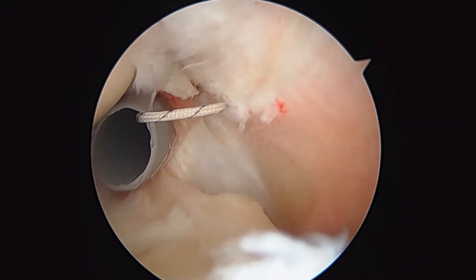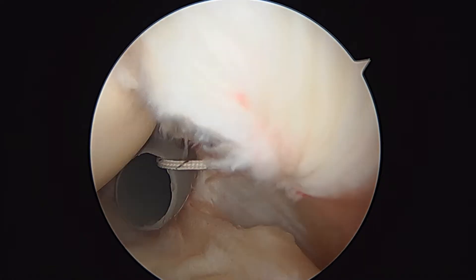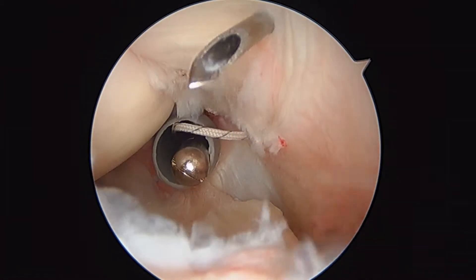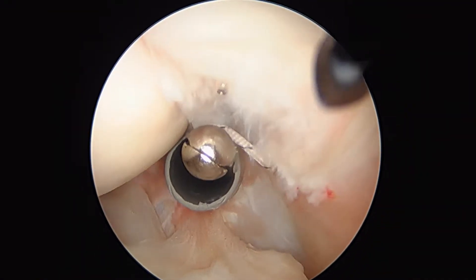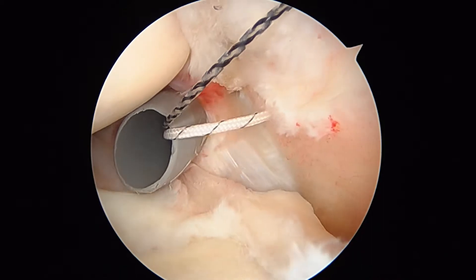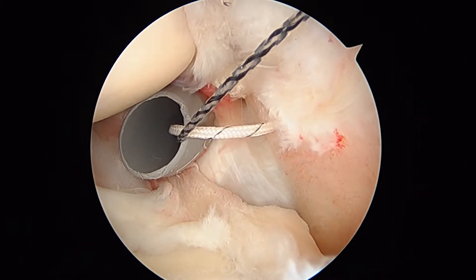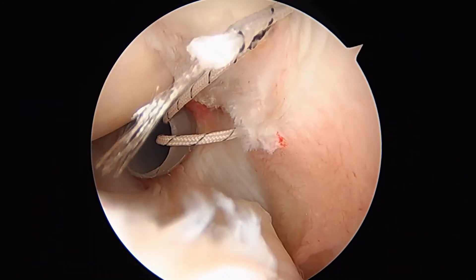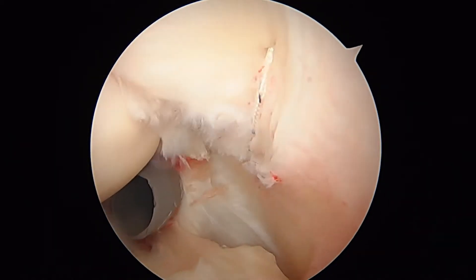We're going to take the spinal needle and pass it now on the posterior side. We'll go ahead and pass a relay through there, then load the other end of that black and white suture. You can see how that's going to give us a loop — see how that's going to go across there and function as a ripstop stitch.